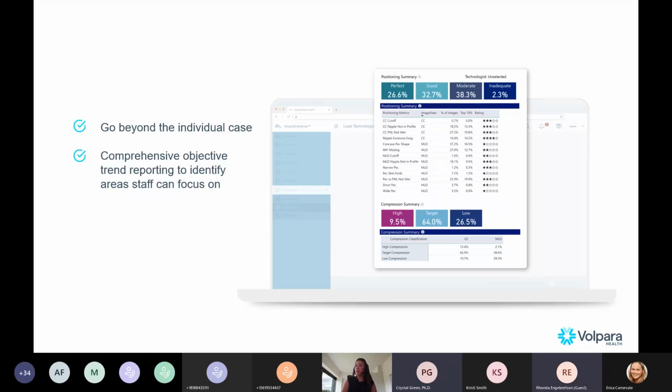And I think that we really talked about that corrective action and really focused on that just a bit ago. But do you ever drive your technologists back into enterprise to kind of close that loop? Yes. So even before we started using the individual reports that you guys would run, when we would do our monthly QA, part of that would be for them to go into enterprise and look at their scorecard, give us feedback on their scorecard. So it really has forced them to take the time to get into enterprise and really navigate around. That's great. Yes.